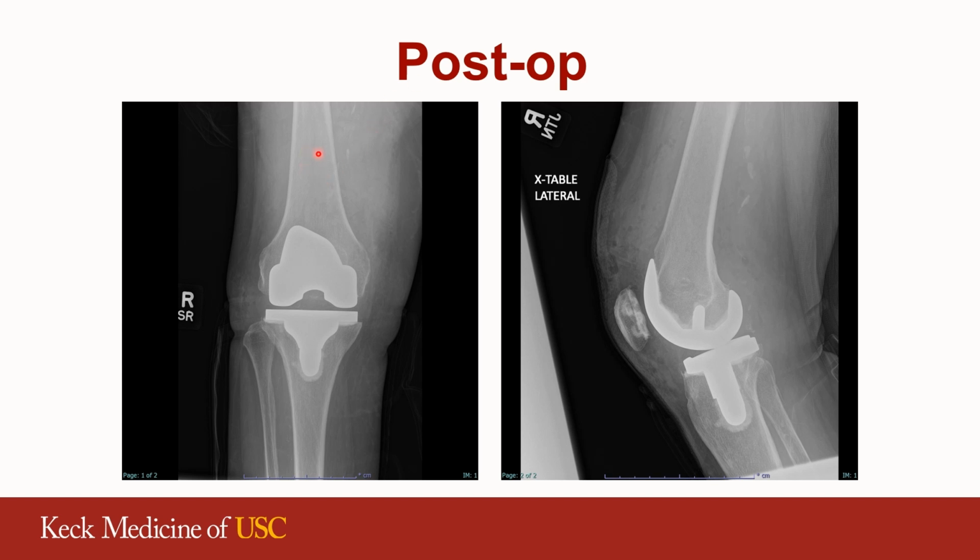Remember, we started out with the varus knee with lateral tibial translation. Here we can see we have a neutral alignment between femur and tibia. The components are well mated. The femur is centered and the tibia is perpendicular, and you have a symmetric extension gap. So that is how we go step by step to go from deformity to a balanced knee replacement. Thank you very much.